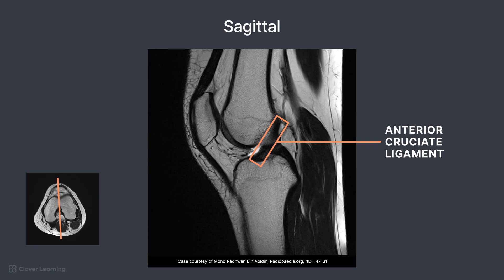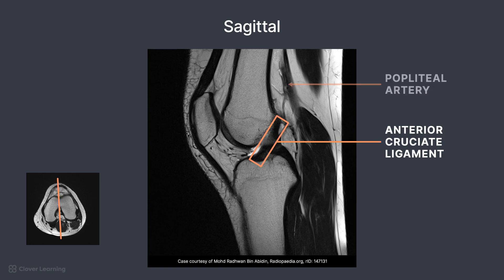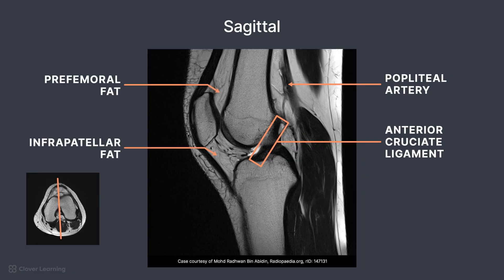One way to remember this is: if you were to draw a capital A, a straight line would first be drawn, somewhat shaped like the ACL. On the posterior side, the popliteal artery is demonstrated. Infrapatellar fat and the pre-femoral fat body are located near the patella.